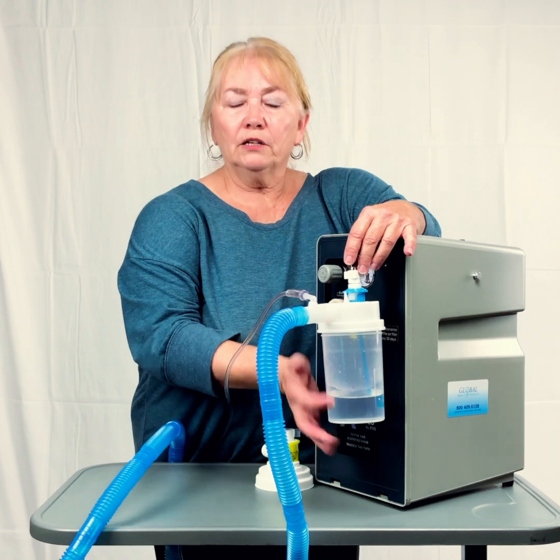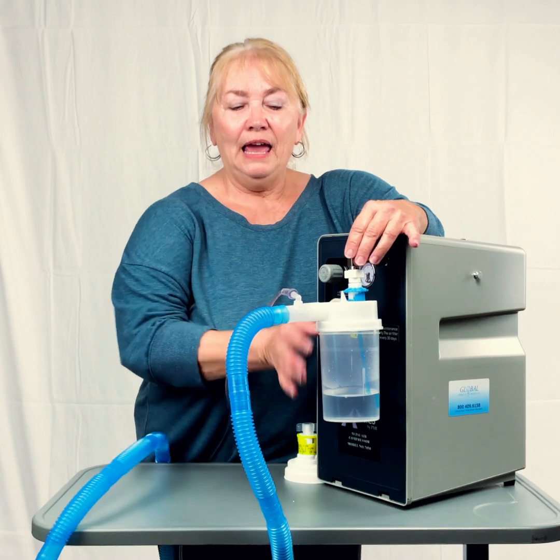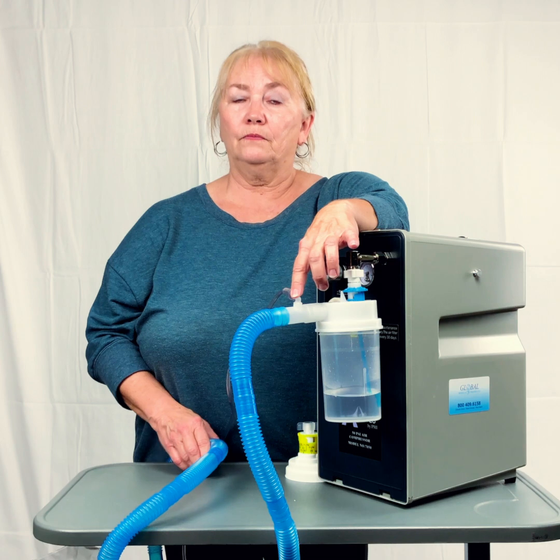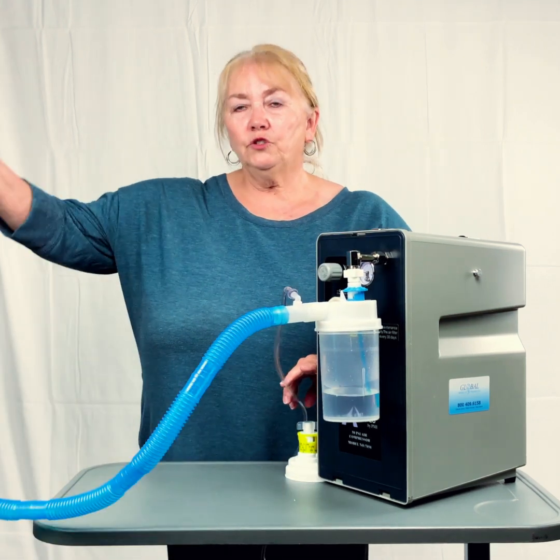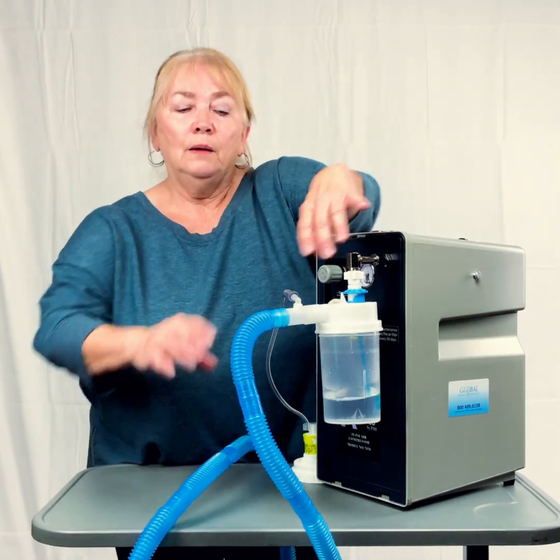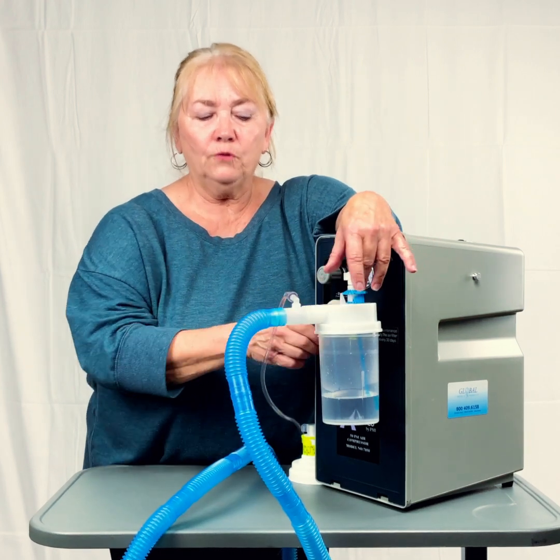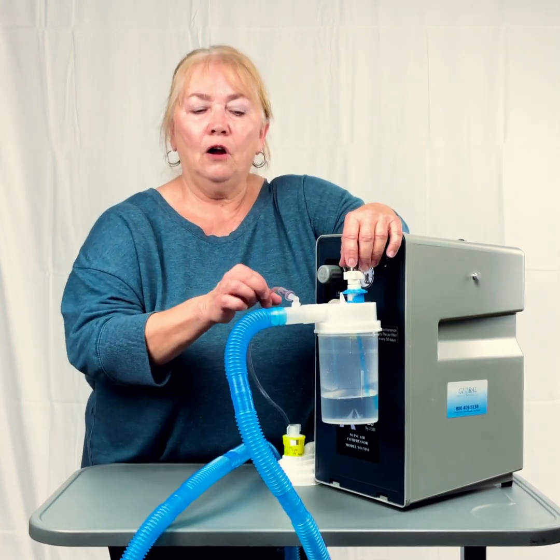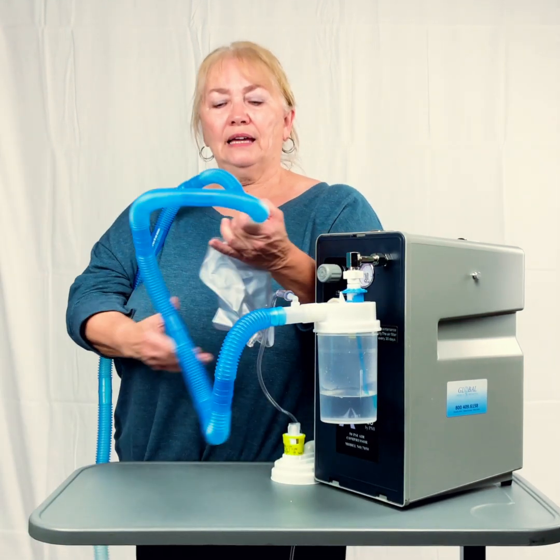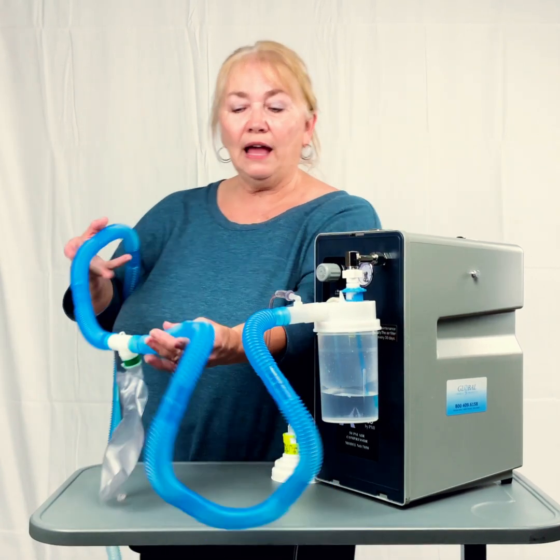We use distilled water in our nebulizer bottle. And then if you're having oxygen, the oxygen is hooked up right here. And I'm using blue tubing, which is normally what you'll see. We also have the white tubing, just to make it easier for you to see as I'm doing things. So we have our bottle set at 40, and then our oxygen. We have our tubing, and then this is our drain bag.